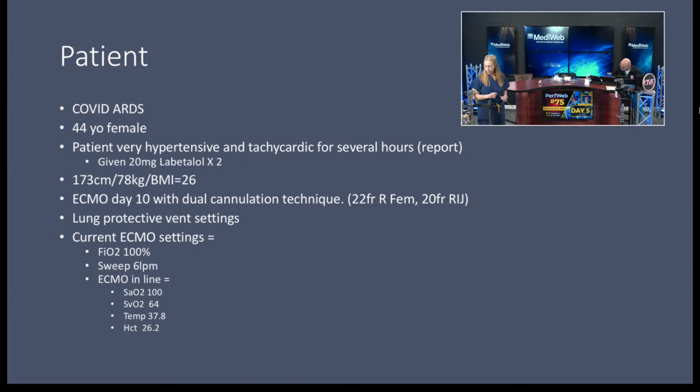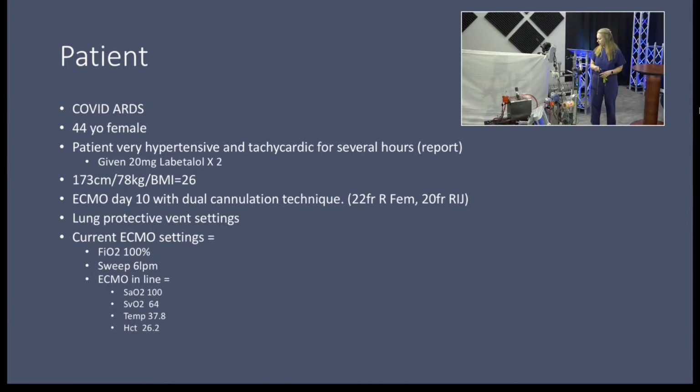So you want to make sure you have a platform that is able to be maneuvered around the hospital and get into those elevators, because it's just not going to be you and that patient. They often have other devices on them, and you're going to have multiple people going with you. If you get to the point where you are ambulating patients, you're going to have the patient, often a chair behind the patient, a physical therapist, a nurse, the perfusionist, and the device, all trying to walk in unison together when you're rehabilitating these patients. So the ability to be mobile is something you want to consider.